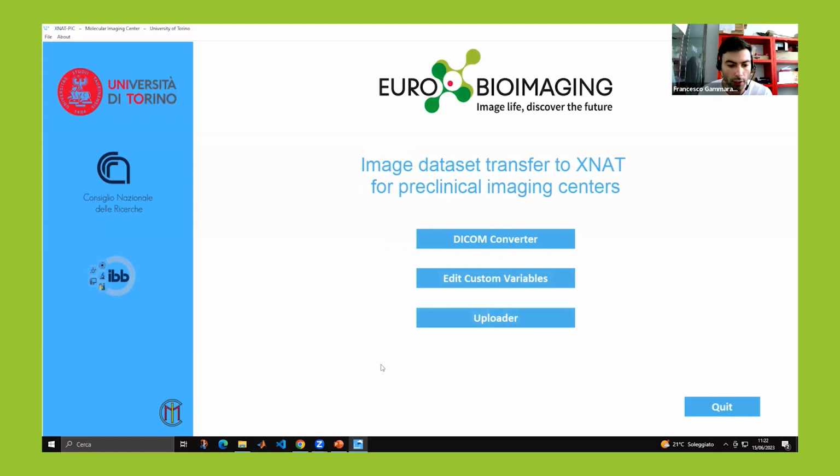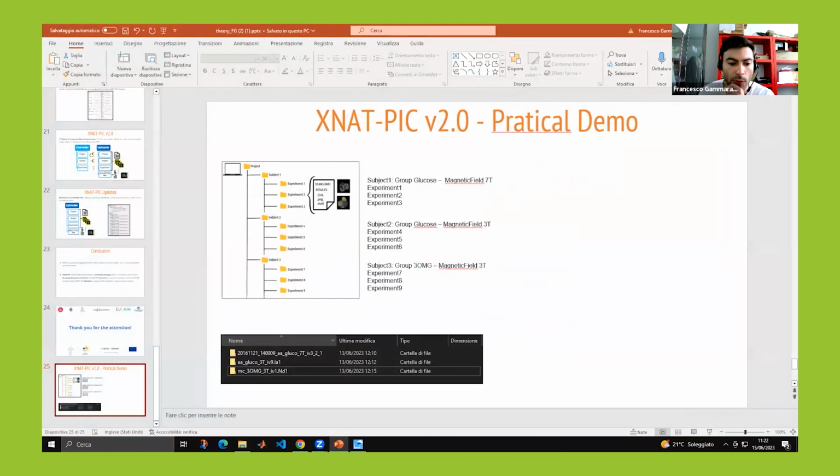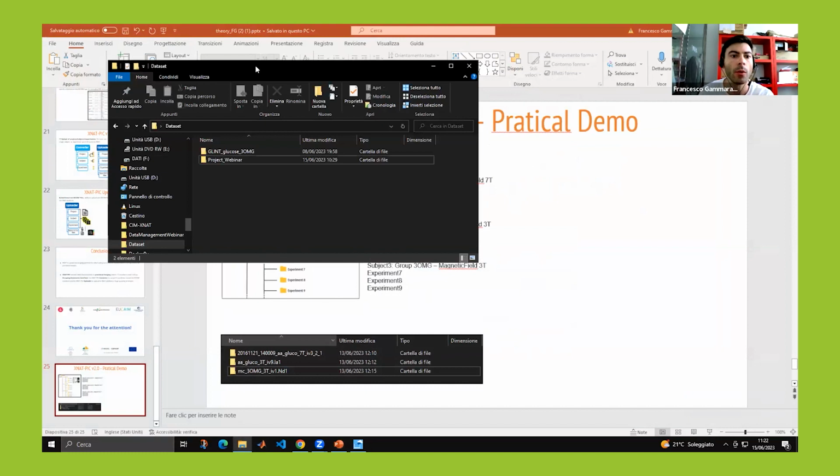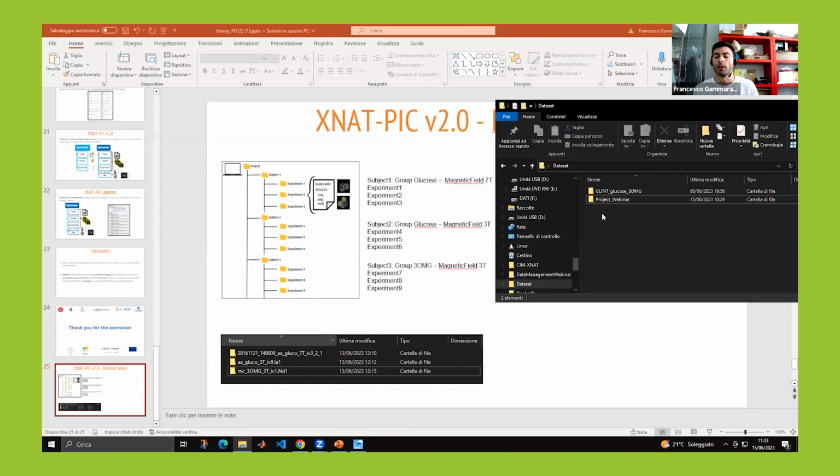First of all, we can start from a real project, a project that we have prepared for this webinar, and we can see the extraction of this folder. This project, called Project Webinar, has three subjects.